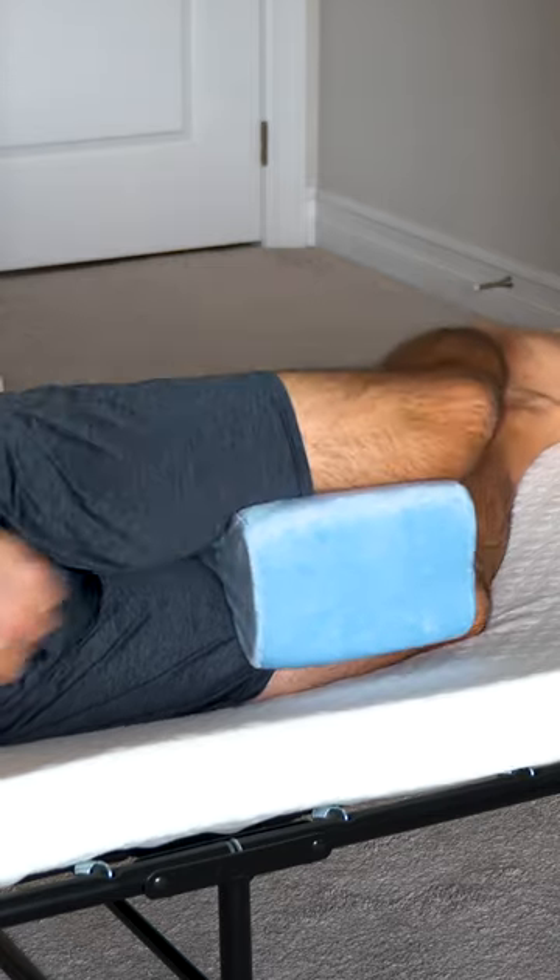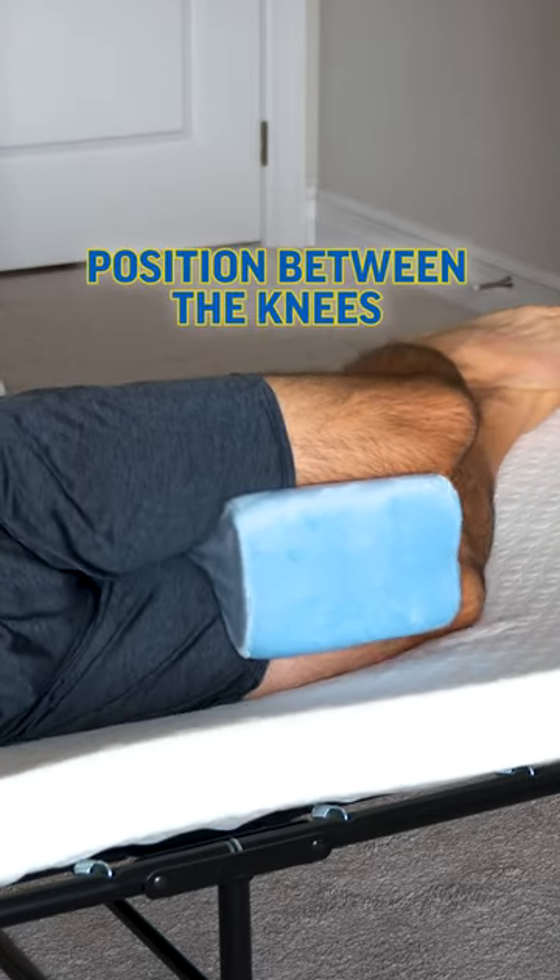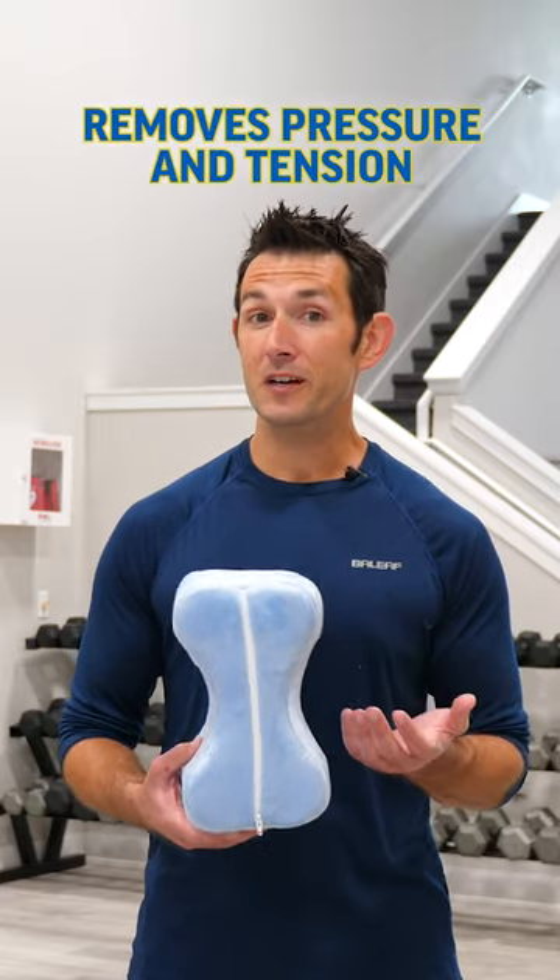Simply position the Contour Leg Pillow between the knees while laying down on your side. What you're going to immediately notice is the proper alignment of the hips, and this is going to help take pressure and tension off of the low back all the way down to the lower extremities, into the knees and ankles as well.